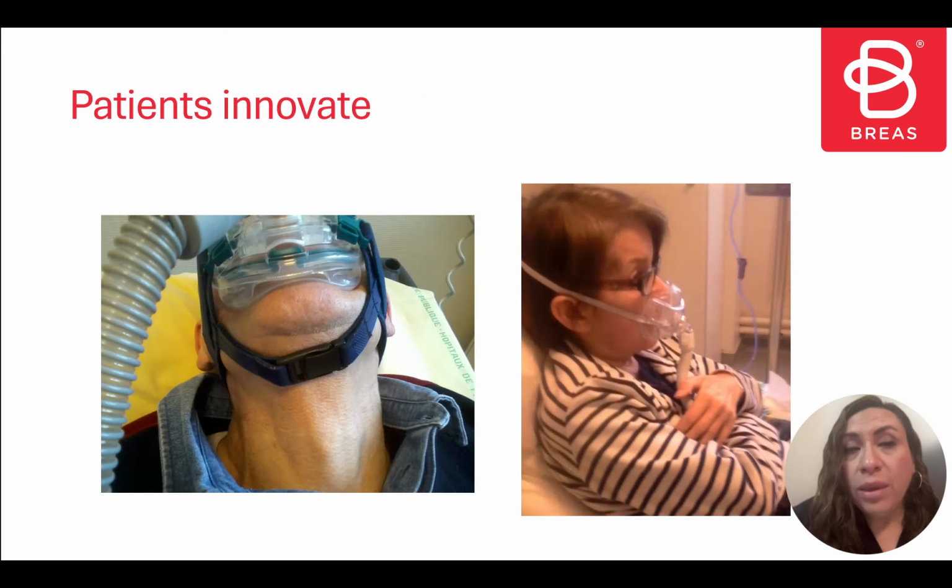Sometimes we are surprised because the patients themselves are very inventive. They can innovate. For example, here we have a patient who had an opening of the mouth. He didn't want to use a chin strap because, as you can imagine, putting on a mask and then a chin strap can be something not very pleasant. So, what did he do? He decided to sew on his own, as seen here. A little cloth and then a hook, right here, and it prevented this patient from opening her mouth.